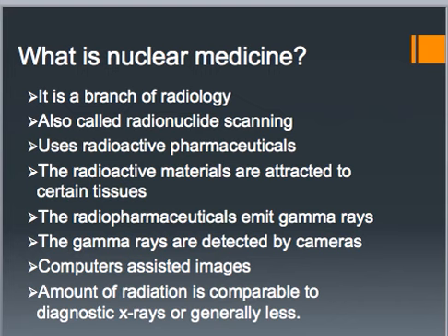So even though the radiation is different, the amount is less than or comparable to general x-rays. Most of the time it's even less than a standard x-ray would be.